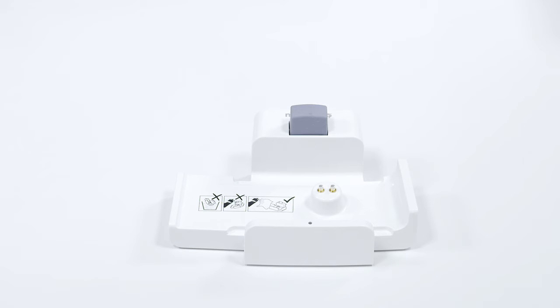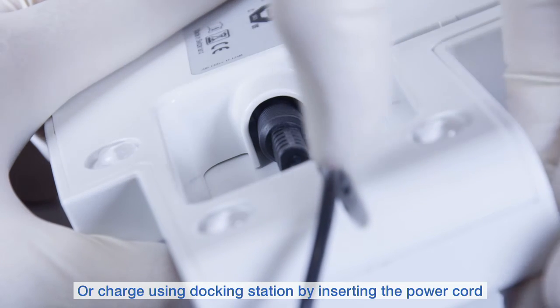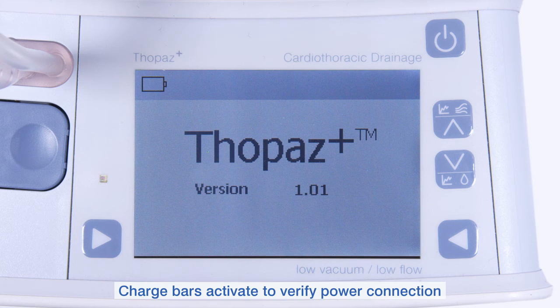Alternatively, use the docking station to charge Topaz Plus. The docking station is recommended for the most accurate fluid measurement. Pick up the docking station, turn over and carefully place the power cord into the socket. After attaching Topaz Plus, you will then see the charge bars which verify charging.